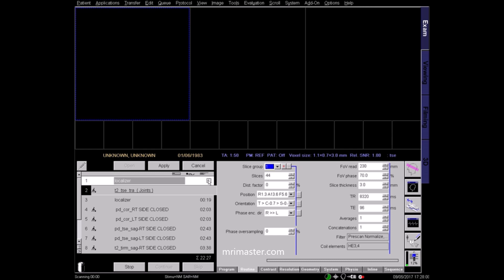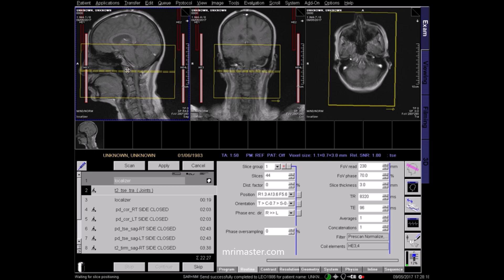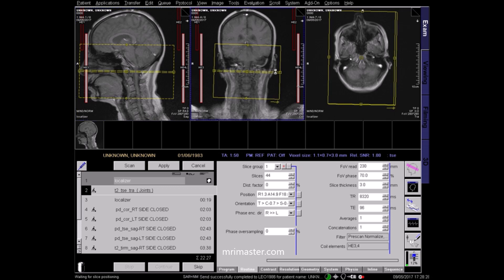Begin with the three-plane localiser sequence. On this localiser, plan the first sequence which is a T2 axial. This will be used to plan all of the subsequent sequences in this protocol. To ensure coverage of the TMJ joints, you should include the frontal sinus superiorly and the lower lip inferiorly. On the coronal plane, angle the positioning block perpendicular to the midline of the brain and C-spine. Check the centring in the axial plane and apply.